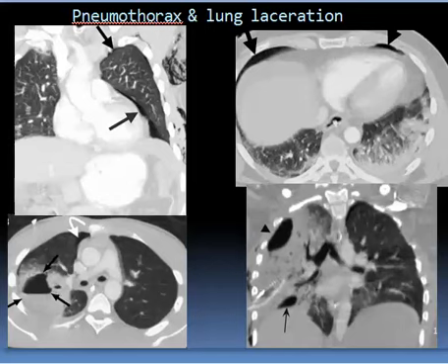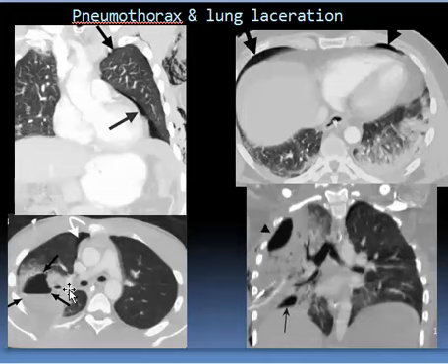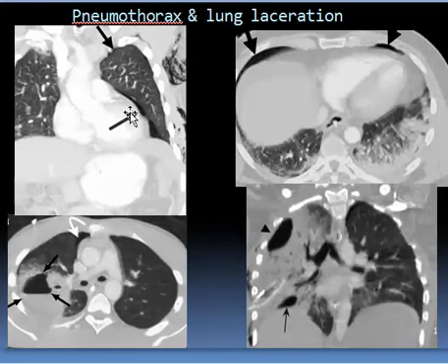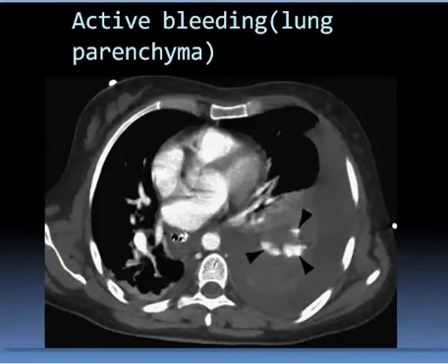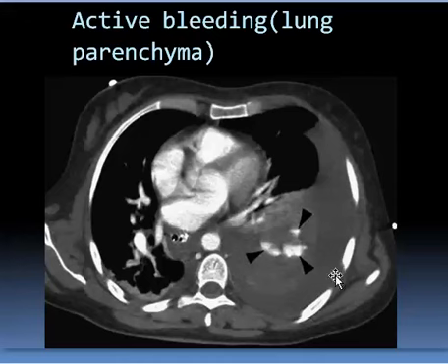Here we have pneumothorax — the pneumothorax is located here. There is laceration of the lung with fluid inside the lung laceration. Here is pneumomediastinum and this is surgical emphysema. So we have pneumothorax, surgical emphysema, and active bleeding.